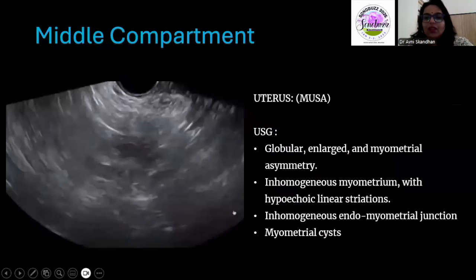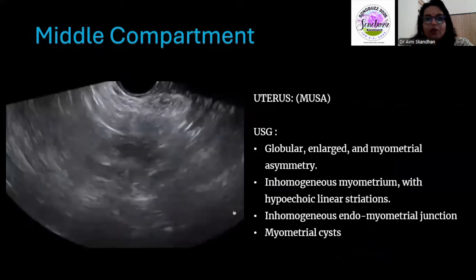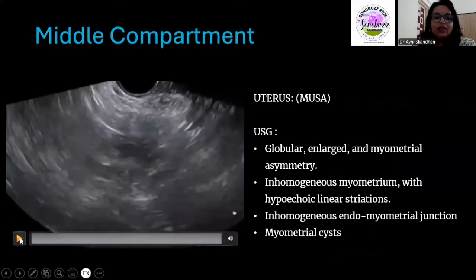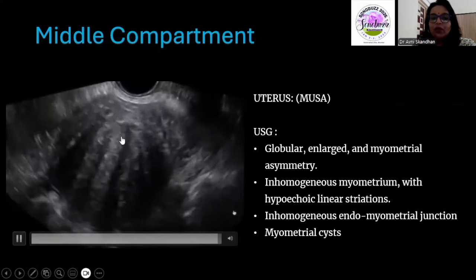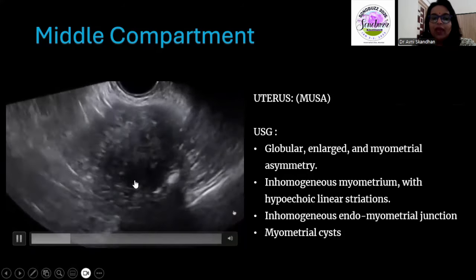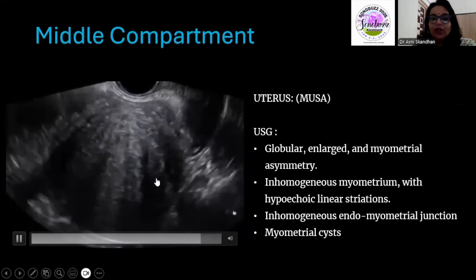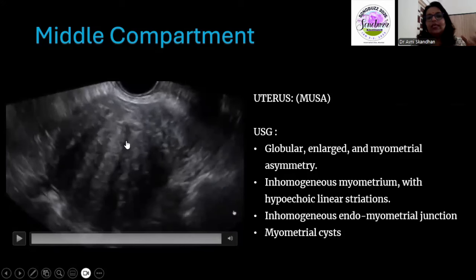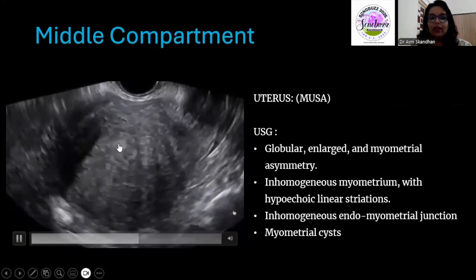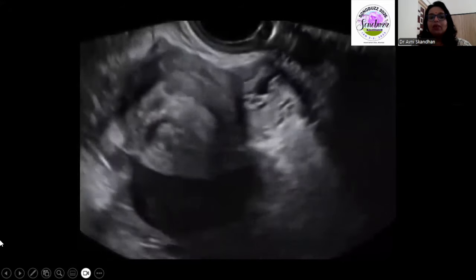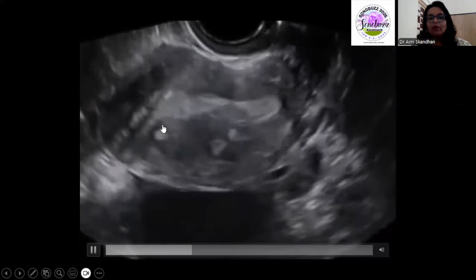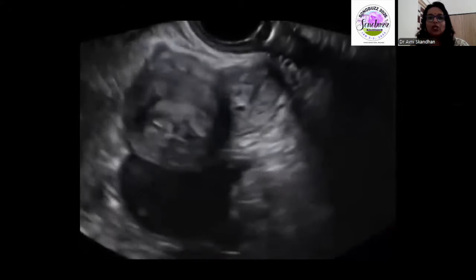Coming to the middle compartment, we look at the uterus following primarily the MUSA guidelines for adenomyosis. Here you can see a classical case of adenomyosis: a globular uterus with diffuse heterogeneous myometrial echoes, thickening of the myometrium, venetian blind-like shadowing, and hyperechoic reflections. This is the classical appearance of adenomyosis. The endomyometrial junction is not well appreciated — it is very hazy. In addition, you can get myometrial cysts or echogenic deposits in the myometrium representing ectopic endometrial tissue.